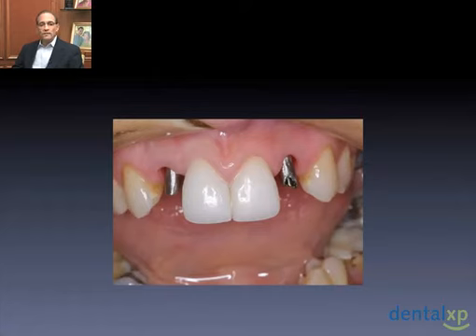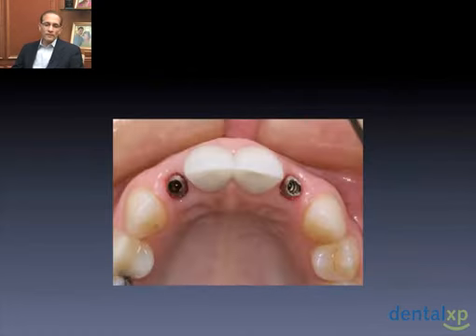But still, we can see that these provisional abutments really don't support the soft tissue, and neither would the impression. If we were to take an impression at this stage, there'd be no way for us to predict what the soft tissue contours would be. Looking from the top, the same thing: you can see that there's space around the provisional abutment, and it's really inadequate for moving forward with a final impression and final restoration at this stage. What we'll do next is modify those provisional abutments and create an underlying abutment or tooth form shape that we would expect in a final restoration.